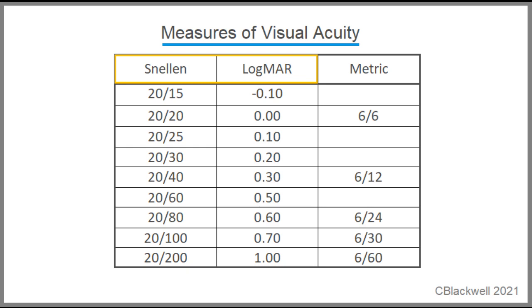These studies use a notation for vision that is different from the familiar Snellen notation, called logMAR. Without going into how it is generated, just note that 20/20 equals 0 on this scale, 0.3 equals 20/40, and minus numbers are better than 20/20.